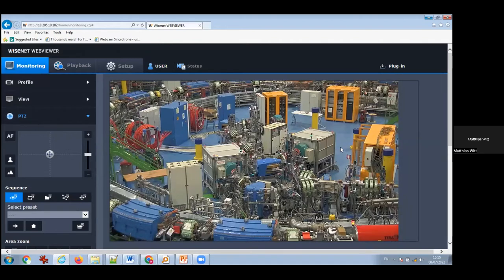In Marburg, we have it separately. So it's easier, for example, if the carbon source shuts down, we can still treat protons because we can easily access it. So if money doesn't play a role and space doesn't play a role, would you still build it this way? Well, I presume that if there was no limitation, I would have them outside.